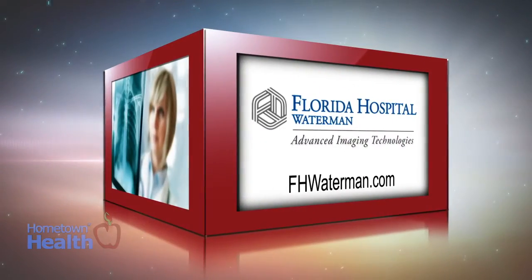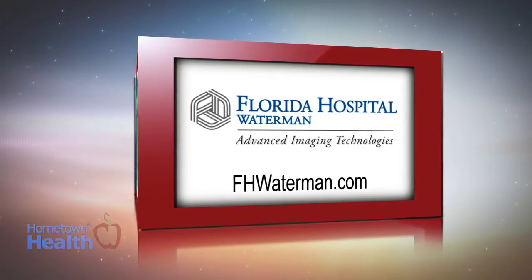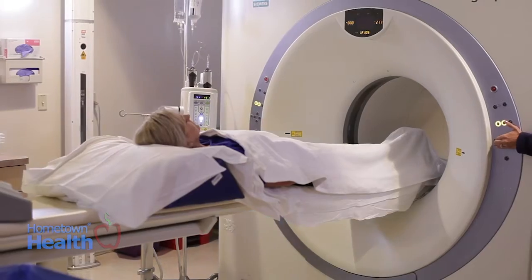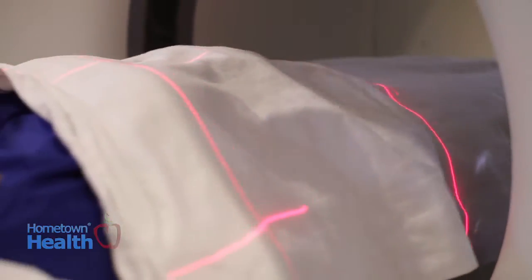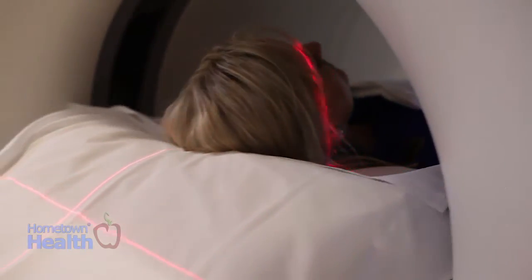Dr. Marc Siegel, Diagnostic Radiologist at the Center for Medical Imaging, explains MRI technology and how it's used. MRI examinations are ways of imaging inside the body, looking at different organs. It's actually a large magnet, and it images the water in your body, because for anyone who's taken high school chemistry and still remembers, water is actually magnetized. And there's a positive and a negative pole like any magnet, and that's what we image with MRI exam.